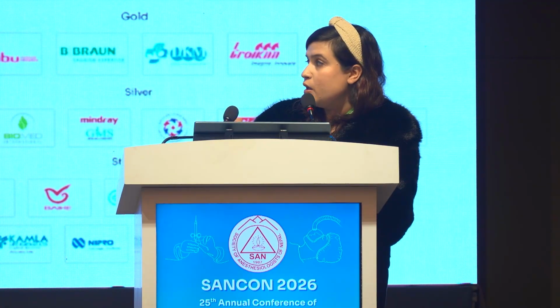And next, you mentioned resuscitation and hemodynamic monitoring. We have newer kinds of PICCs available nowadays, something called Power PICC. It allows the use of vasoactive drugs, and we can also use it for measurement of central venous pressure. It also has a flow rate of 180 to 300 ml per minute. So they are designed in such a way that hemodynamic monitoring and infusion of vasoactive drugs are possible. If we're really talking about fluid resuscitation or massive blood transfusions, we simply have our large bore cannulas to defeat your physics. I don't think we need any central access for massive transfusions or fluid resuscitation.